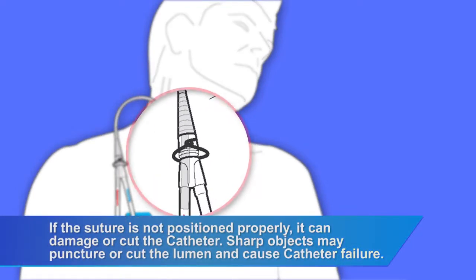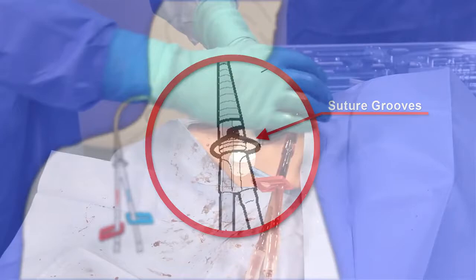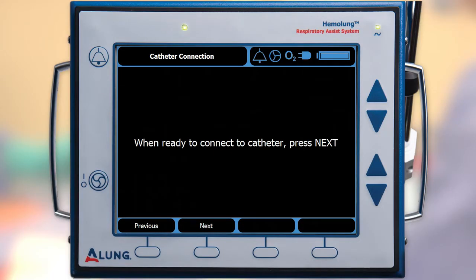Secure the catheter to the skin using a strong suture that sits in the groove of the catheter hub. Also secure the catheter lumens to the skin using the supplied grip lock devices. When you are ready to connect the blood tubing, press next to stop the pump and proceed to the on-screen instructions.